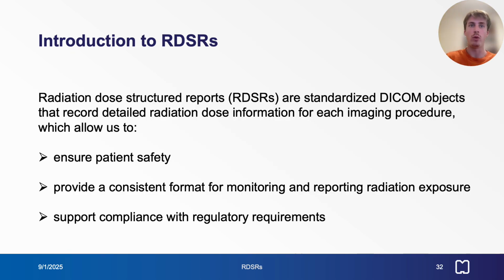Radiation dose structured reports, or RDSRs, are standardized DICOM objects that record detailed radiation dose information for each imaging procedure, allowing us to ensure patient safety, to provide a consistent format for monitoring and reporting radiation exposure, and to support compliance with regulatory requirements.